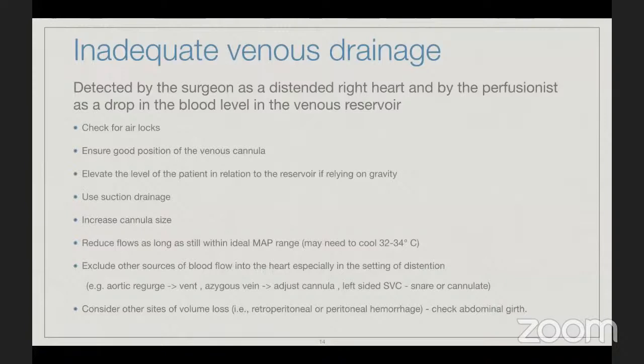If you remove the tube clamp, yes, exactly, you remove each cannula clamp separately, so at least you make the problem solving process easier. You will know which cannula is not working. This is one of the safety measures most surgeons do. Exactly, you remove one by one to make sure that each one is draining properly. Thank you.